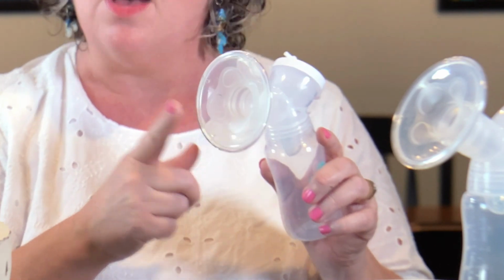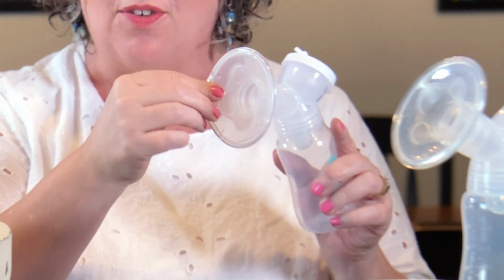This is the flange. It's the part that touches your breast when you pump. Evenflo flanges come with an insert inserted into a larger flange. So the first thing you're going to do is take out the insert. Here's the hard flange and here's the insert. This gives you two different sizes so you can choose the one that best fits your nipple. So let's go ahead and set the insert down because we definitely want to clean that.